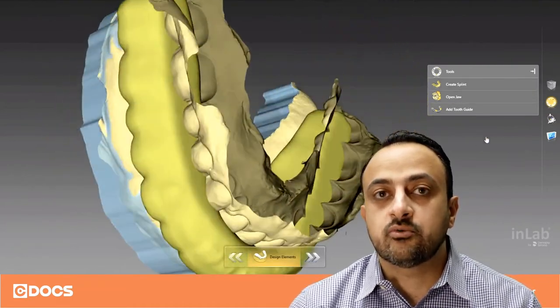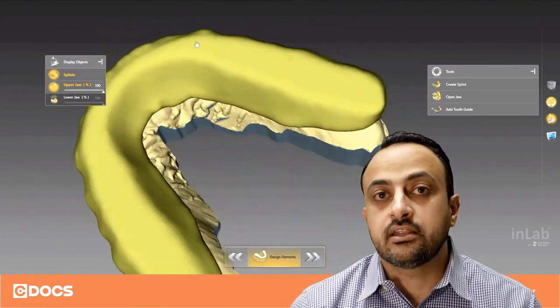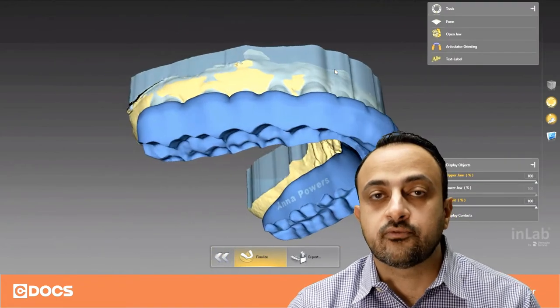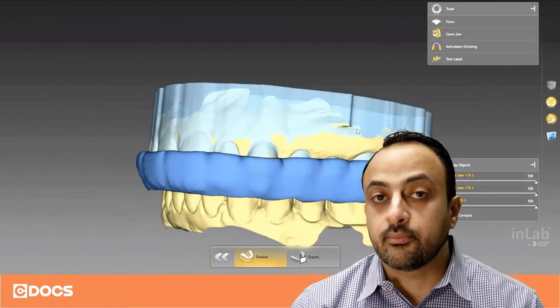That space gives me room for the material. It also gives me room when I go into the final stage here in the design to create the occlusal space and to give myself room for all the excursive movements. So it's a really nice feature to be able to use a leaf gauge to create the proper bite record registration.